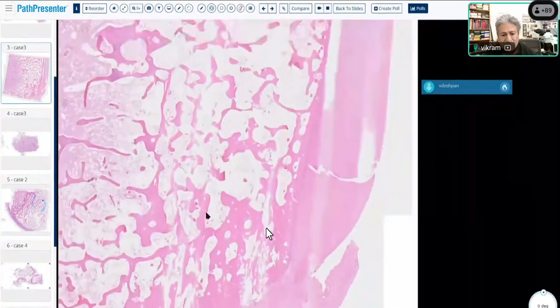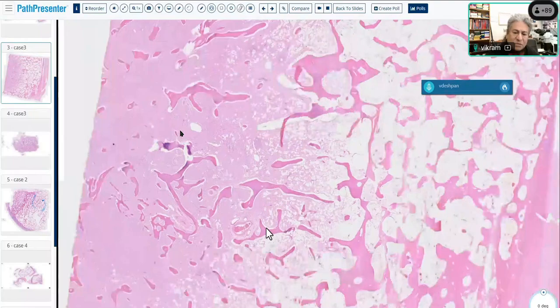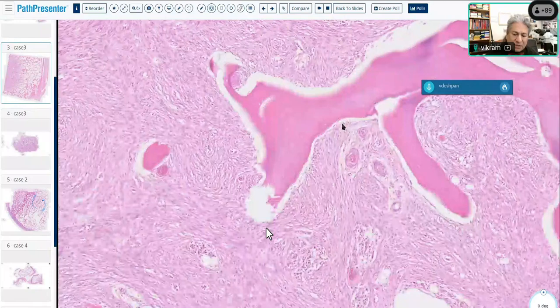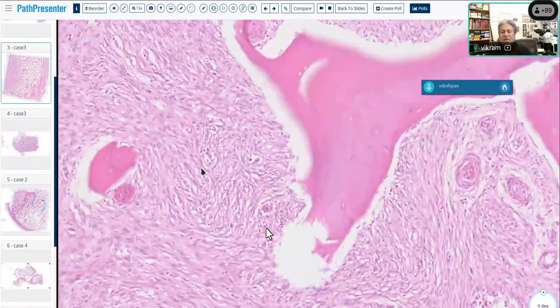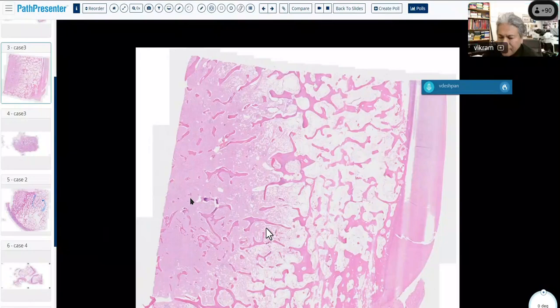So what I was trying to get back at is the parosteal osteosarcomas are generally on the surface and stay on the surface. This particular one infiltrated the adjacent bone. And this is what a well-differentiated osteosarcoma looks like. So again, big, thick seams of bone and those atypical cells. Now remember, the important thing about the diagnosis of an osteosarcoma is this is one of those osteosarcomas, along with well-differentiated osteosarcomas, that do not require additional chemotherapy unless they dedifferentiate, unless they become higher grade, right?